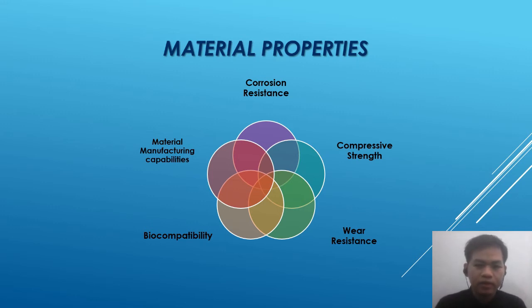Wear is damaging, deformation, and removal of material that happen gradually. It is essential to select the right material with high wear resistance to ensure the implant longevity.